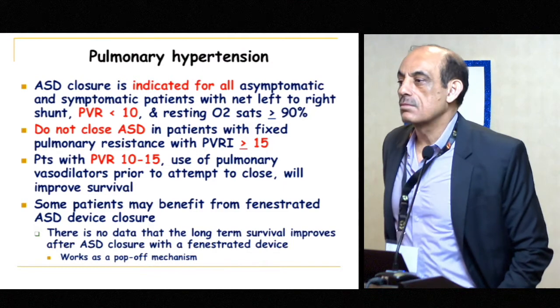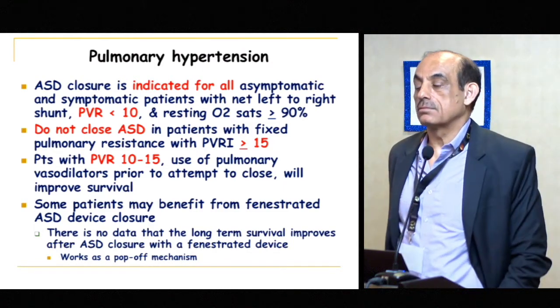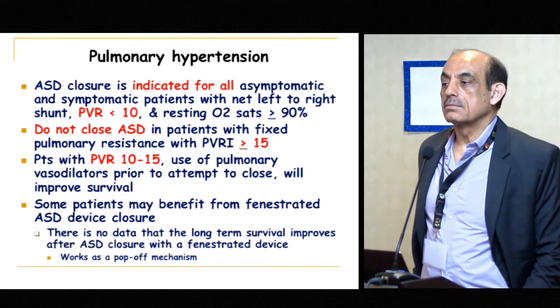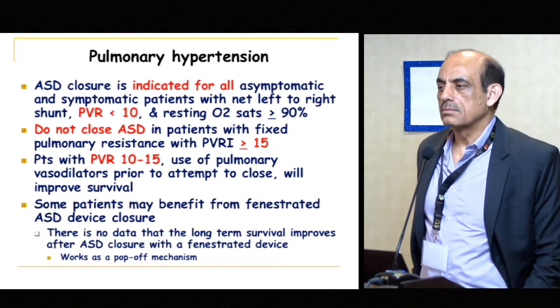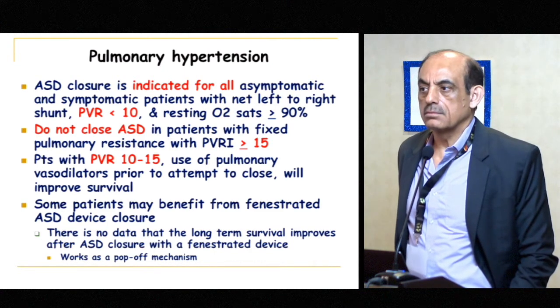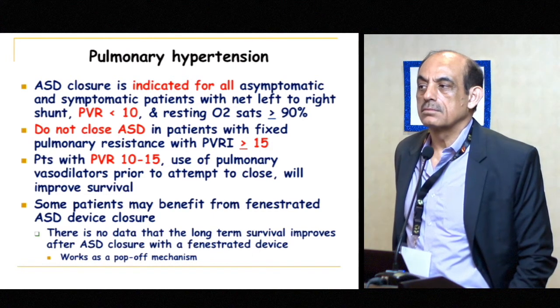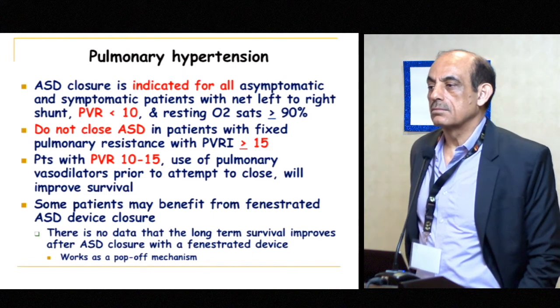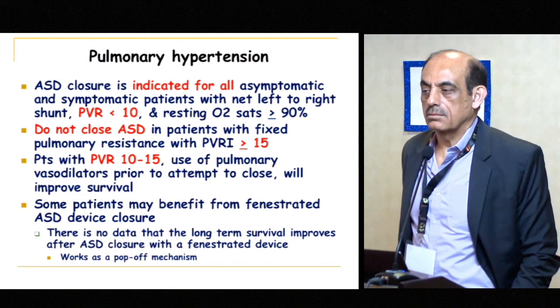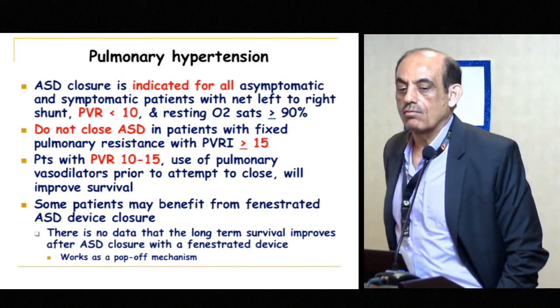And a lot of times people were having a hard time getting the LA disc correct, despite all the maneuvers you were showing. And it was clear that, think about it, the esophagus is right behind the left atrium. The left atrium is not that big, and with fairly big ASDs in little kids, the disc doesn't have room, and with the stiffness of the TE probe against it, it can't. It's not a wall where it can kind of move things. And Craig, I said, hey, do that again.